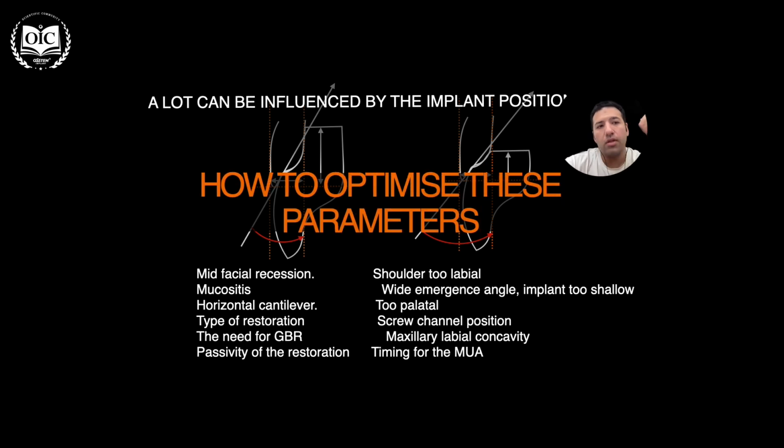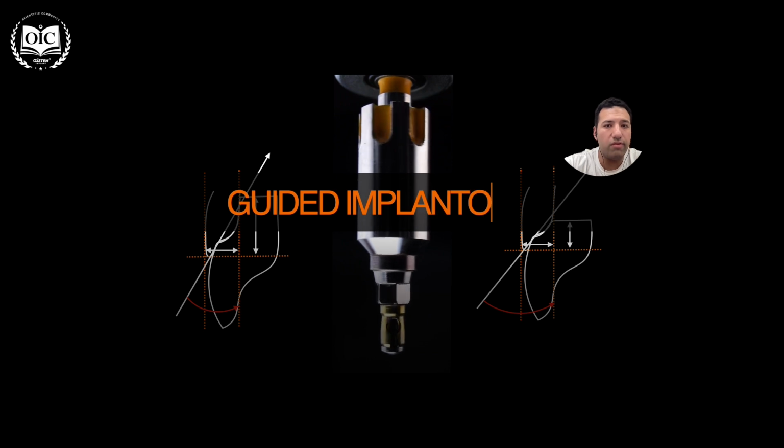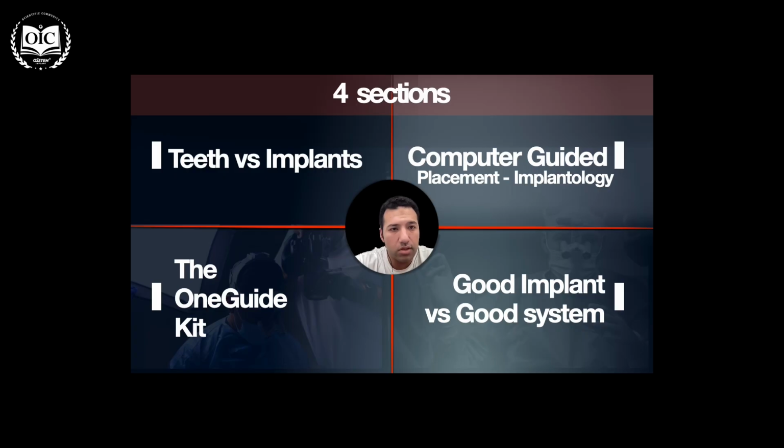So those are the three optimization points that I think about during the guided implant placement, guided implantology section, to provide a good plan that supports a good crown for the patient and that is cleansable with a stable supracrestal complex and a nice looking soft tissue and lasts long.